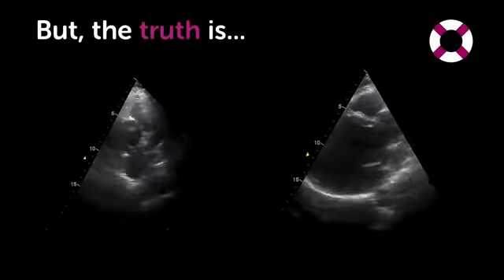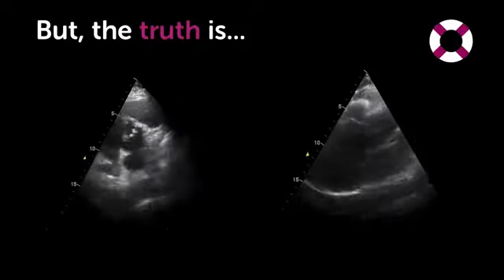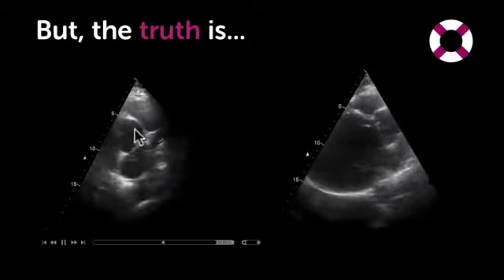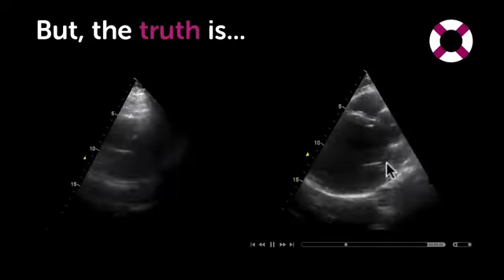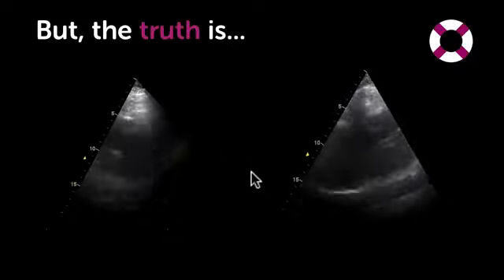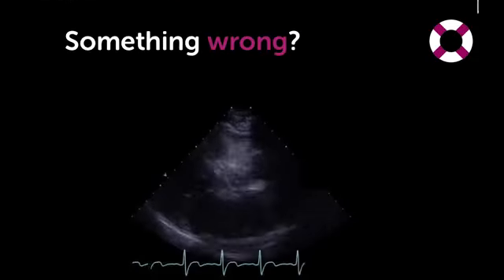In everyday clinical practice, especially if you image obese or elderly patients, your image quality will look more like this. But you can still see the aortic valve, the pulmonic valve, and the mitral valve. So even though the image quality is not so bright, you will still be able to make a diagnosis in most cases. Here is another image with very poor image quality.